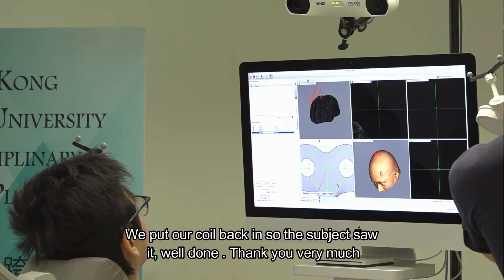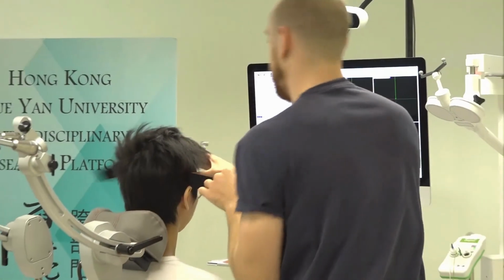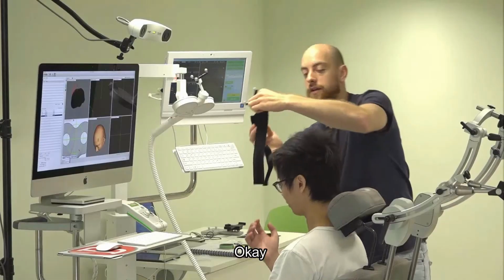we pop our coil back in. That's our subject sorted. Well done. Thank you very much. Okay.